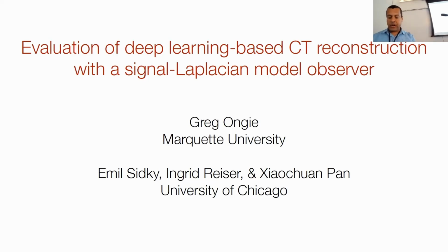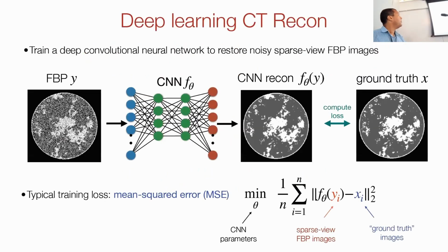So this talk is very much along the lines of what Mark's first example was. Greg's a deep learning reconstruction expert, and we've been working together on this project. Basically, I gave him all my tools for breast CT simulation. And so he's been developing CNN-based reconstruction for sparse view, noisy CT data.